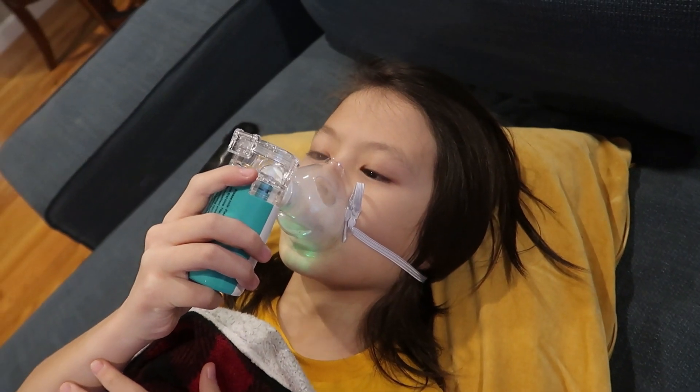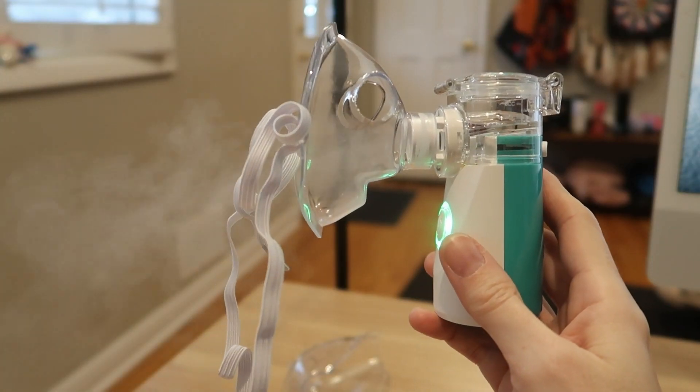Running under 30 decibels, it's much quieter and much less scary for young children than those larger nebulizing machines.